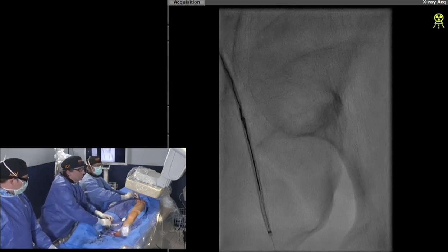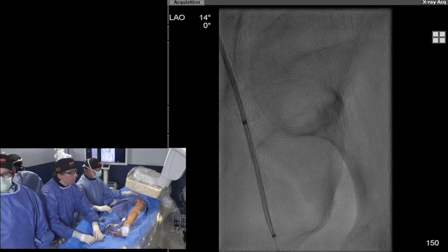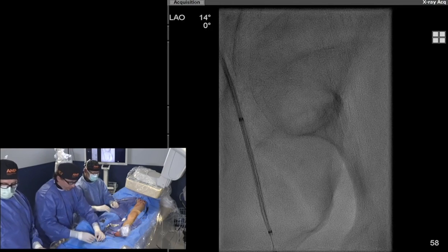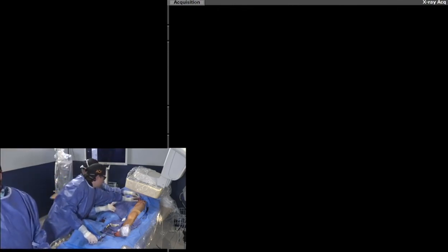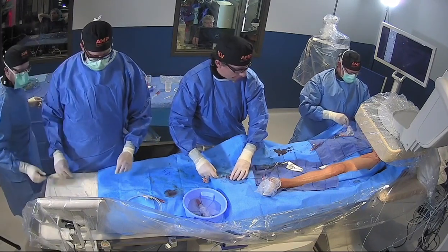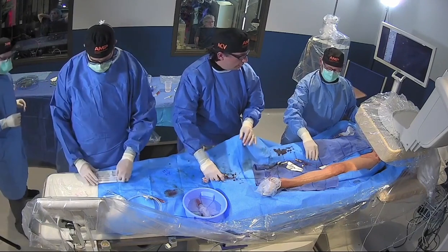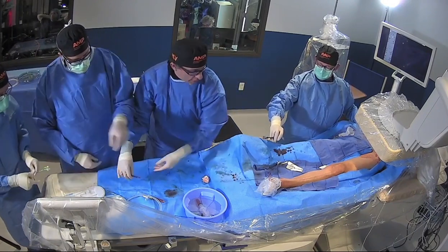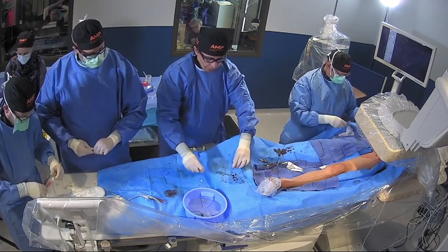It took about 20 minutes to cross the CTO! See — that's why I don't use ultrasound. Was that a compliment? Yes — laser opened! The CTO is about 40 centimeters. Go ahead and take the Navi out. You notice how the retrograde component of the CTO was much easier to cross — the antegrade component was much harder. I'd like to emphasize the escalation strategy the panel mentioned: wire, balloon angioplasty, reverse CART using a CTO wire — we do that quite a bit.